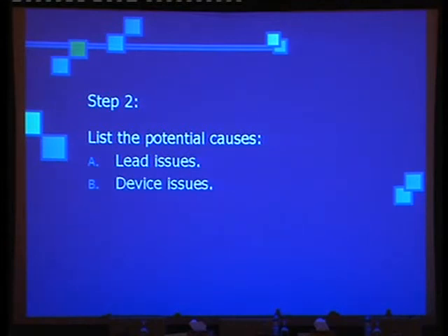Device issues. Device problems are usually late because of the depletion of the device itself, the battery, because the pacemaker is a battery. So device problems usually are due to the depletion.